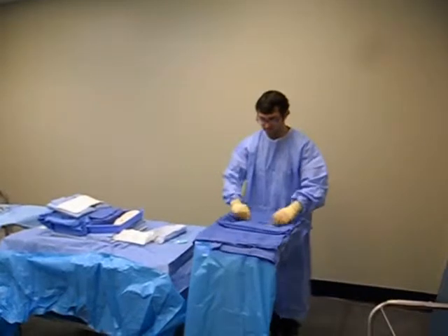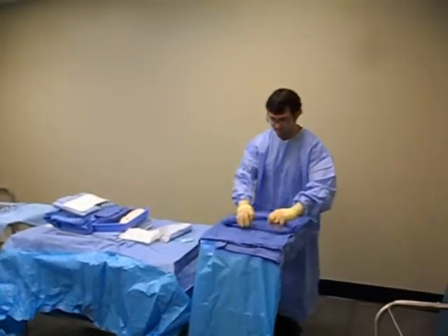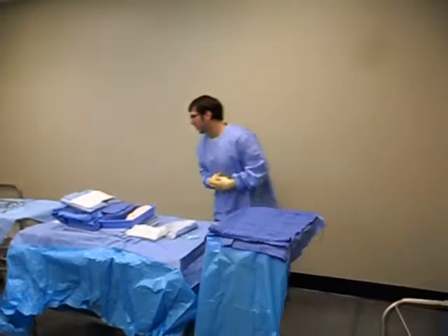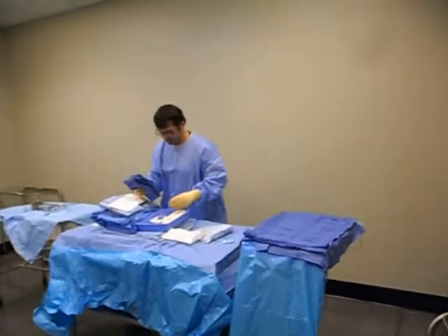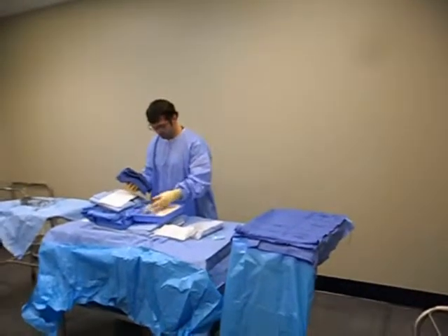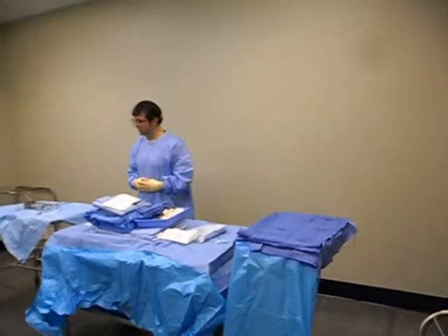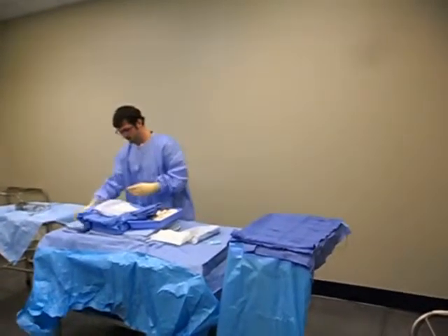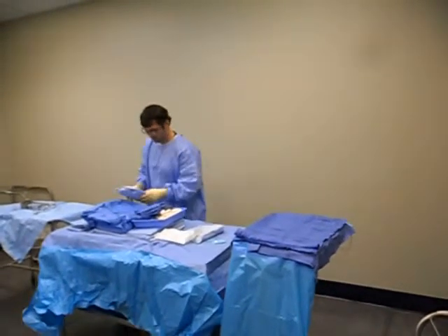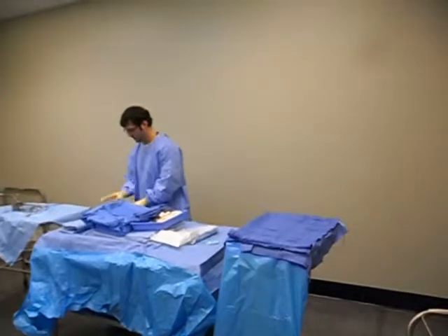I'm going to have a lot of instruments. I'll have to look a little better, but I'm still thinking of cautery at this point. I'm going to need light handles, thinking about the irrigation that I'm going to need. I'm guessing you got a bunch of that stuff in your custom pack. I'll save that just in case the knife comes in. I have this, I have those.